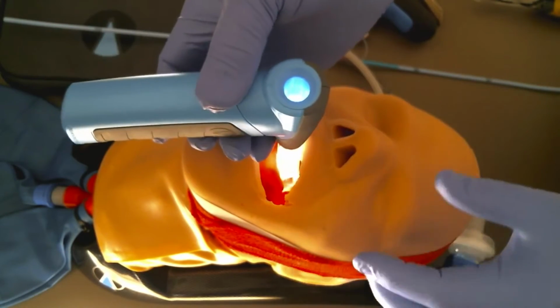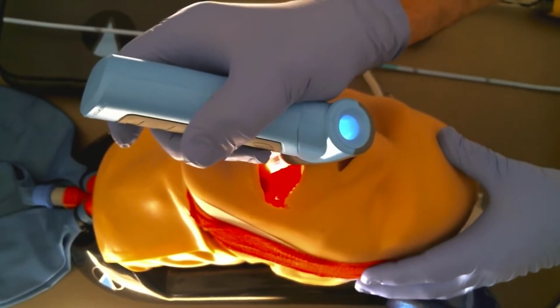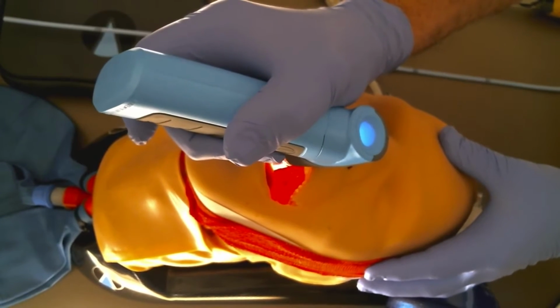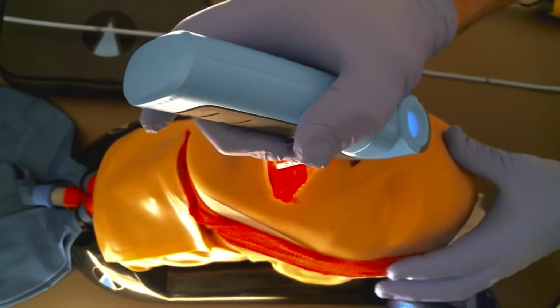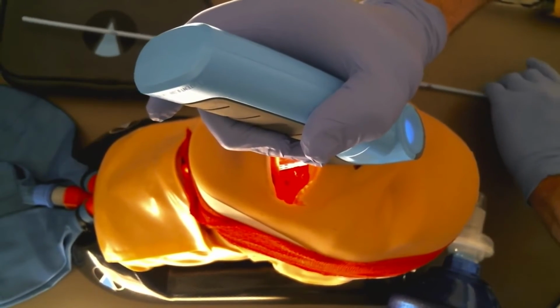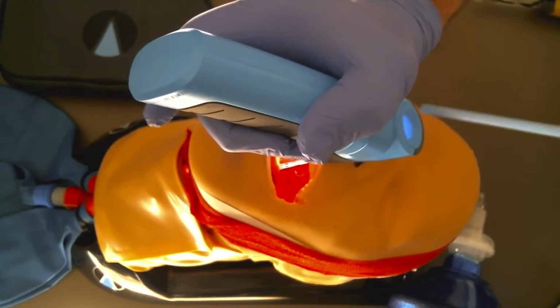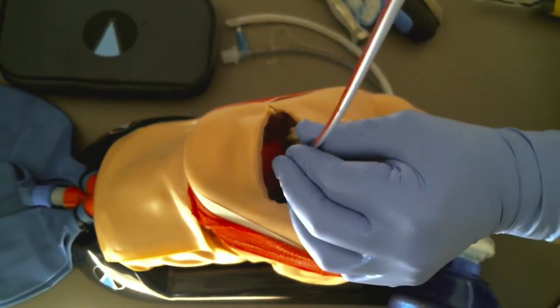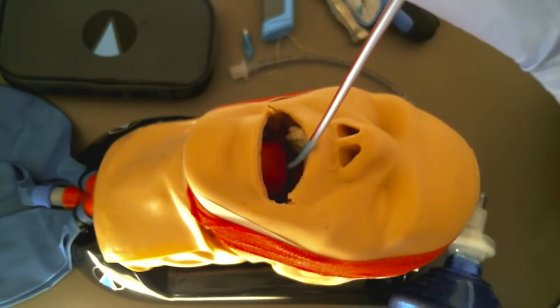So if you go straight in, I'm going to do it with my right hand. You can do it right-handed or left-handed. And up, I can't really see anything other than pink mush. I've gone in a little bit too deep. So I might just correct, come back out a little bit. I visualize the epiglottis. I rotate back. And then I will pass my bougie through the vocal cords. Remove the V-scope, select the proper endotracheal tube.